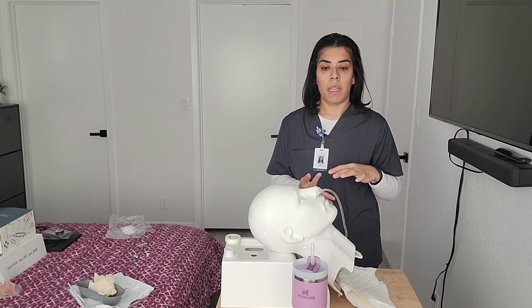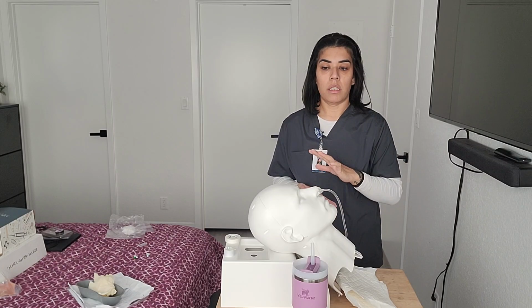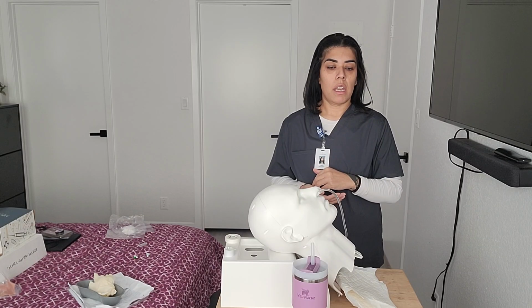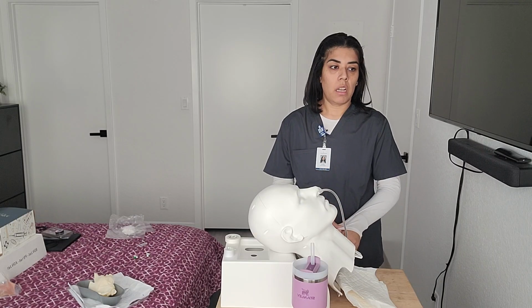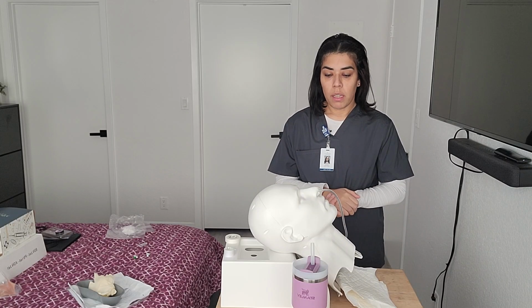You're gonna document the contents that were aspirated, the characteristics of the contents. You're gonna describe the color of the contents. You're gonna document the pH that was within the normal range. You're gonna document the vital signs and how the patient is doing after the procedure as well.